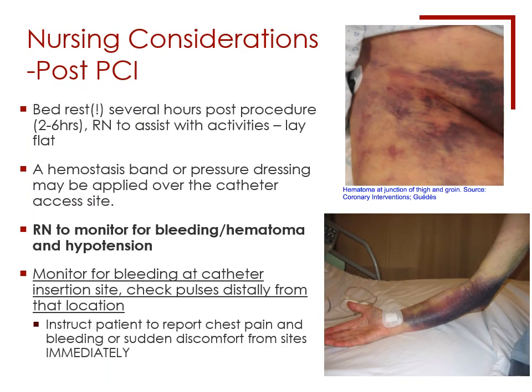Now remember, after this is done, we are in the femoral artery. It's an artery. It can bleed. So you can see there, if it bleeds, it's going to cause horrible bruising. That is called a hematoma. So when you have that hematoma on there, you have to be careful, because remember, hematoma just means it's a bruise. It's bleeding underneath the skin.